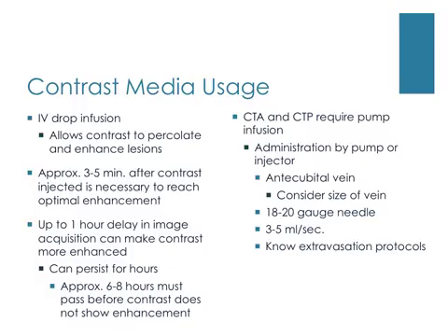The technologist should be well versed about the facility's instructions for follow-up with the patient regarding contrast extravasation. Indwelling catheters shouldn't be used for pump infusion because their small gauge size cannot handle the rate of 3 to 5 mLs per second for the injection.